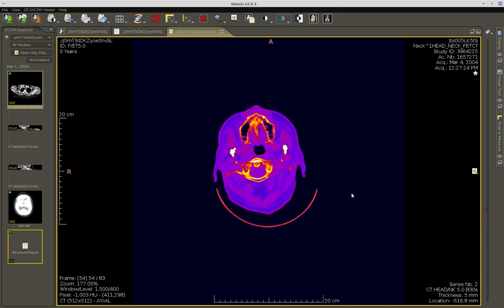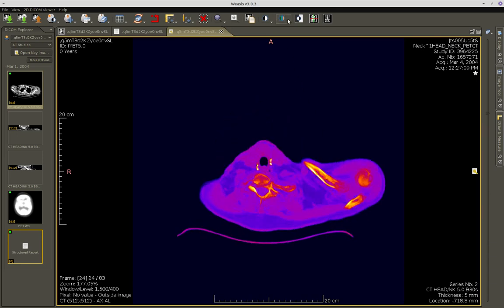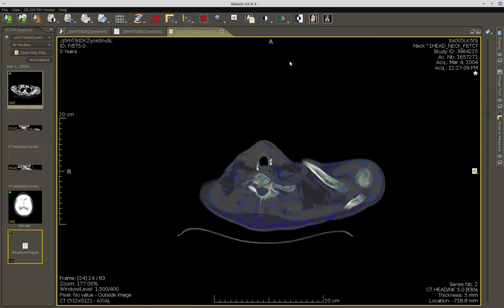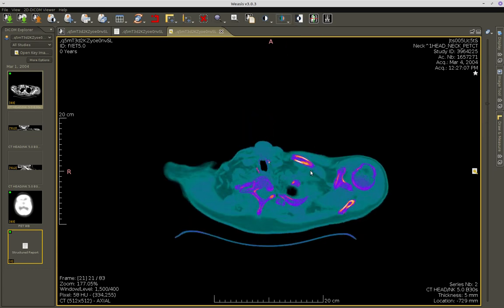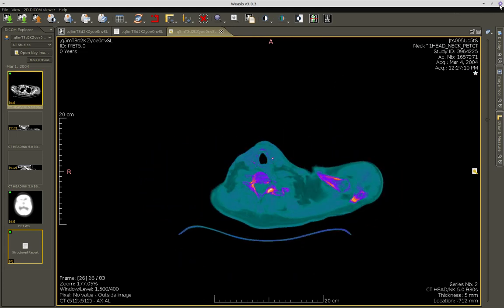This helps doctors actually see different structures when colored in different ways. This is very nice. So this is working as expected, with a couple of issues in the configuration, but that's okay.